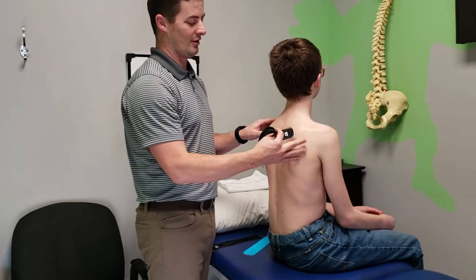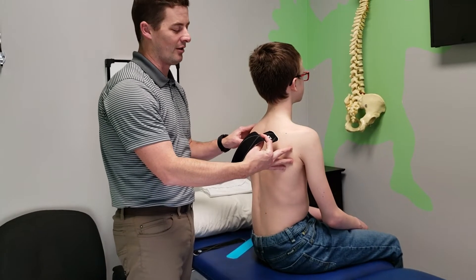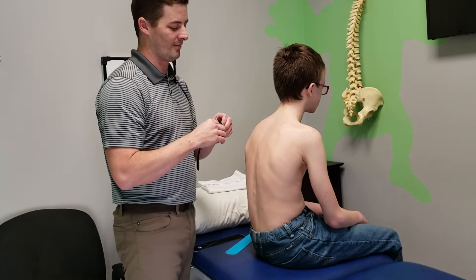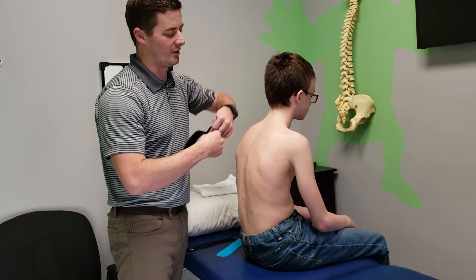So I'm going to have him sit a little bit rounded — go forward just a little bit and round your back just a little bit. That puts the skin on a little bit of stretch so we don't irritate the skin.